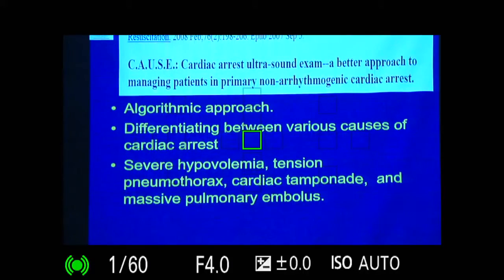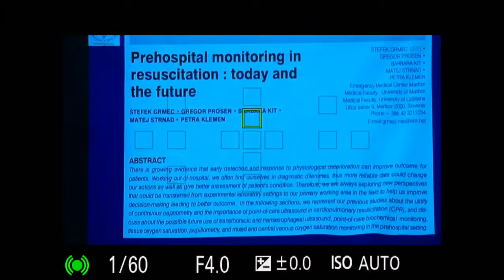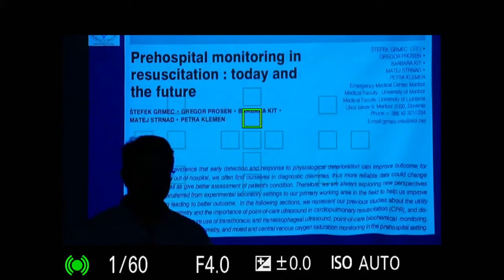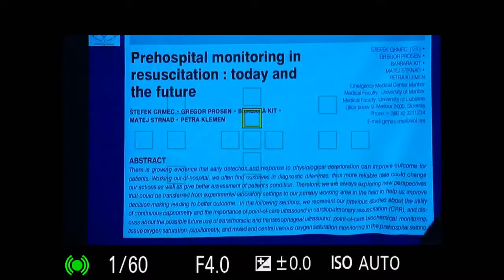We have been practicing for the last 10 years, and remember that arrest can occur anywhere. No time or place is immune to arrest. Now you will say you have to use ultrasound because of the portability of machines; with miniaturization, the machines have become like a smartphone.